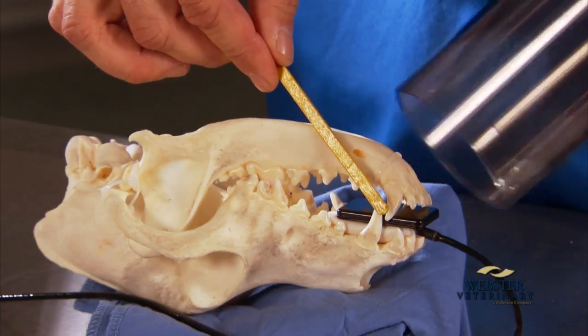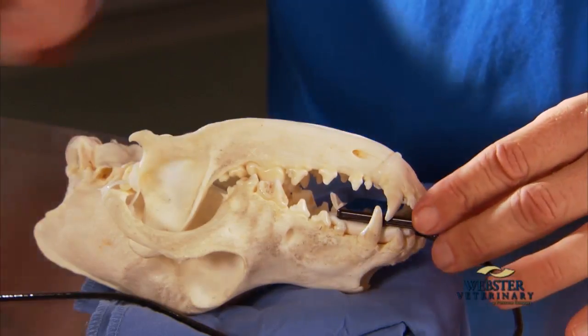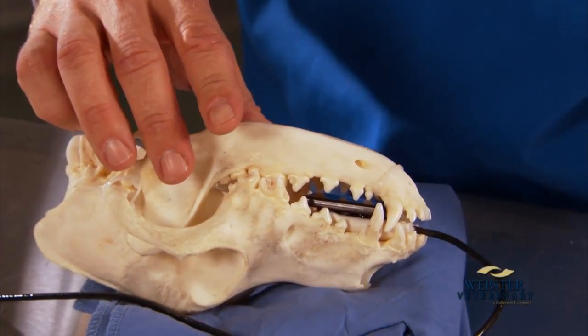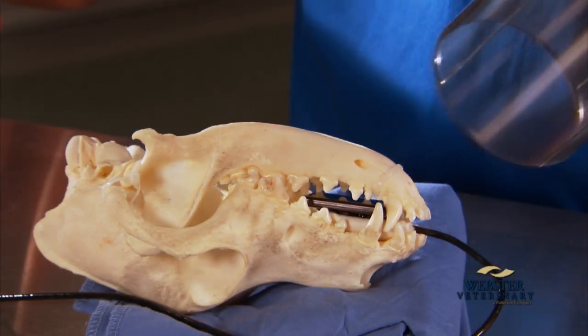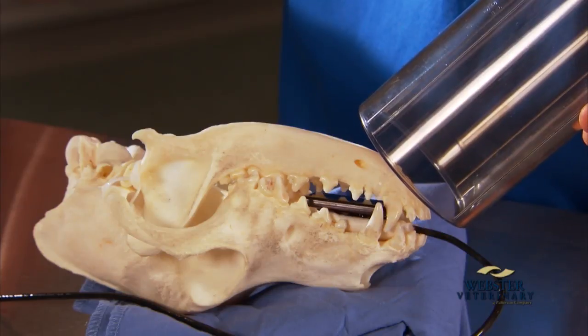When taking an image of the canine teeth, it is necessary to move the sensor caudally into the mouth so that an apical view of that tooth can be attained by moving the tube head into this position.